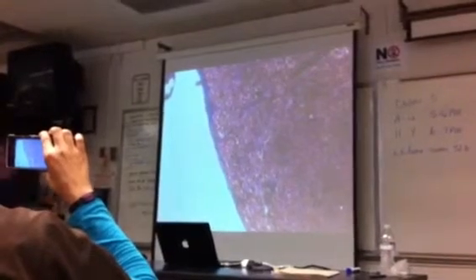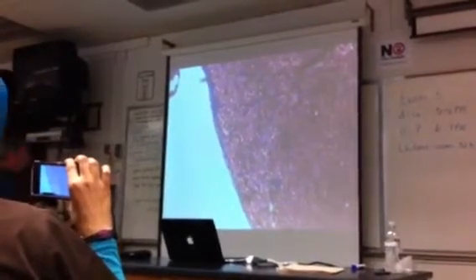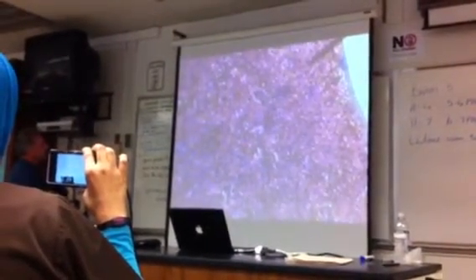Well, anyway, it's got this little outer kind of membrane around it right here, a little capsule of the spleen. And then what we're trying to do is find red pulp and white pulp. Mostly what this looks like is red pulp, but it's just not cooperating.